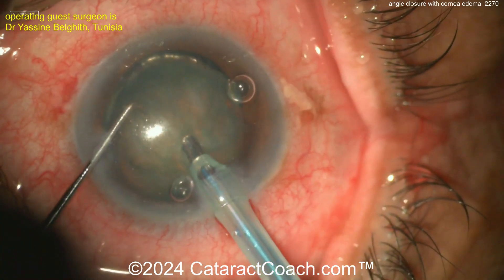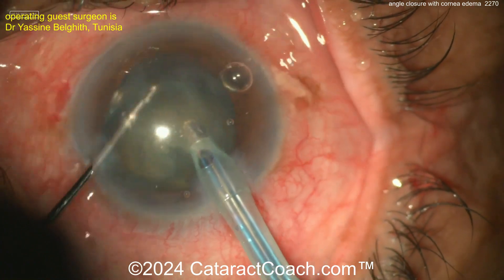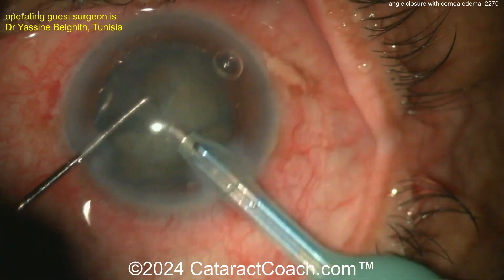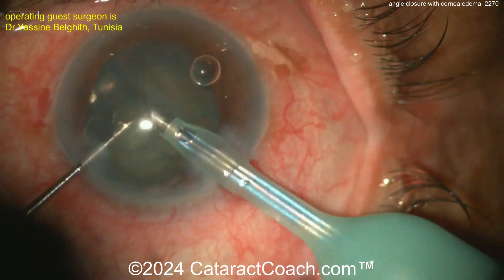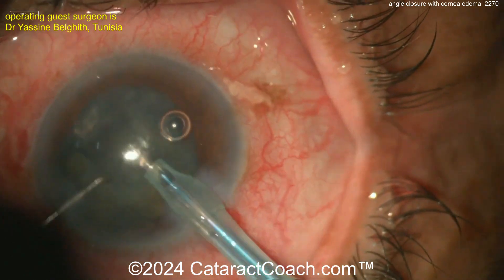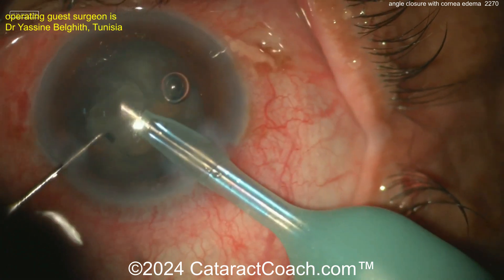The surgeons go in with the phaco probe — chop from the other hand, nice chop — look at that, easy breezy chop down the middle. Some great skills. Phaco chop, chop, and more chop, and we'll get this case done in no time.